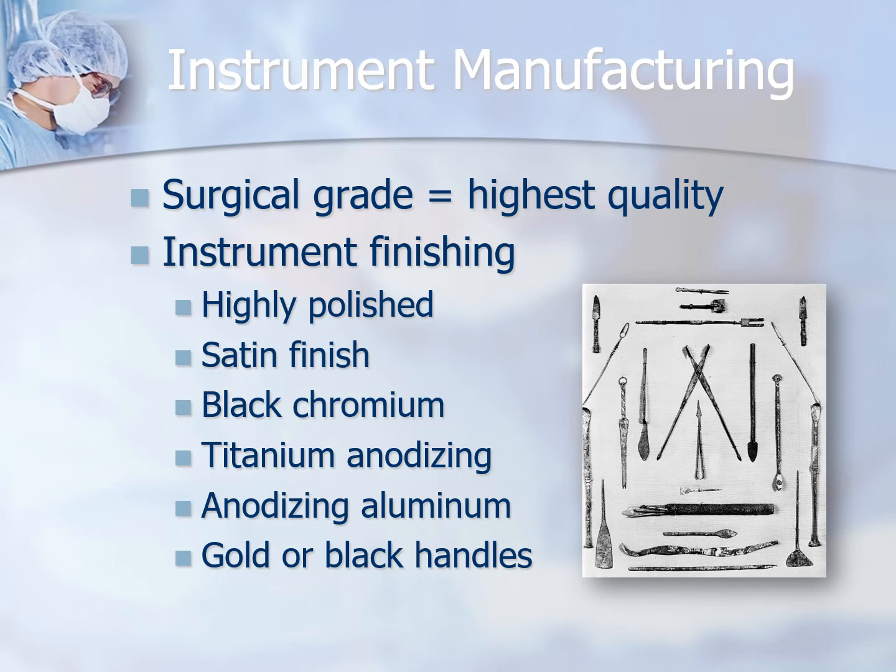And then there's disposable ones which cannot really withstand more than a single use. They break really easily, they break down and erode really easily, so we typically just toss them out after one use. And I can remember being at the VA hospital when I was doing my training to sit for my sterile processing certification, and we would pick up instruments from the floors, and there would be a mix of these 3 different kinds of instruments all thrown together.